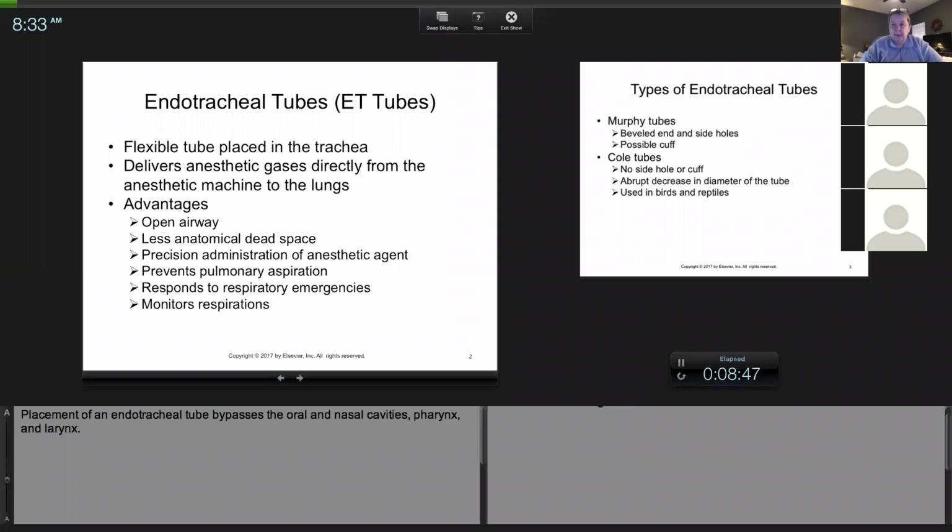One thing, if I have not made clear, if you have a mask on a patient's nose, you cannot bag them. If you squeeze the bag, you're just going to blow up their cheeks. Believe it or not, oxygen and anesthetic just don't push their way down. It really doesn't work. If you needed to bag a patient because they stopped breathing, they were apneic, or say they weren't breathing enough, they were severely respiratory depressed, they need to have a tube in the trachea so you can deliver ventilation. So if you have a respiratory emergency, I'd much rather have an endotracheal tube in the trachea.